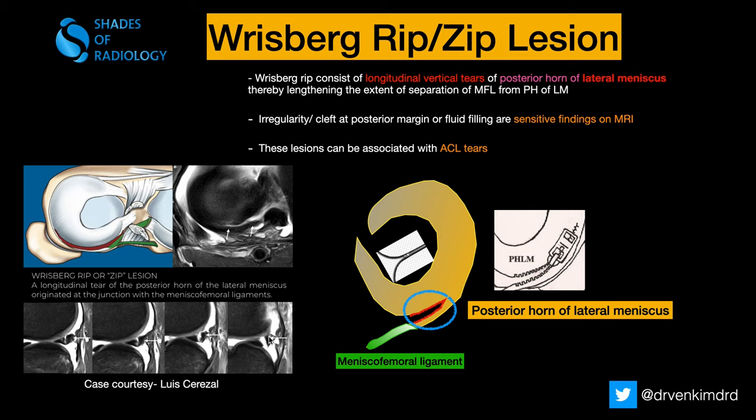One important point to remember: there is another entity called a pseudo tear. Sometimes the attachment of the ligament of Wrisberg can mimic a tear, so we need to carefully evaluate it, which can be difficult. If it is a pseudo tear, it will not be seen in all planes — pseudo tear appears only in the sagittal plane. In the axial planes, you don't see such a tear because of its course of attachment to the posterior horn of the lateral meniscus.